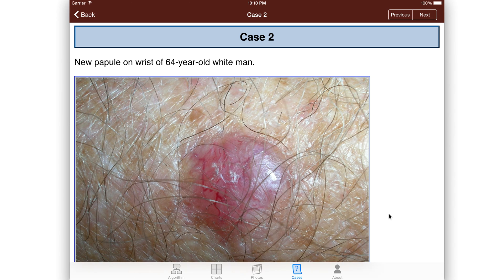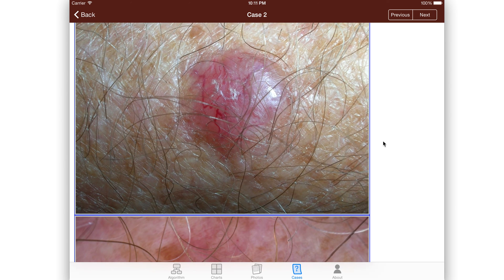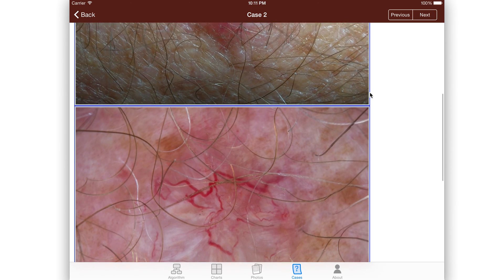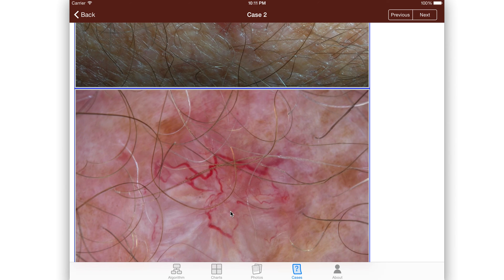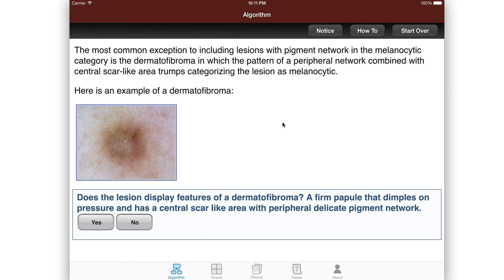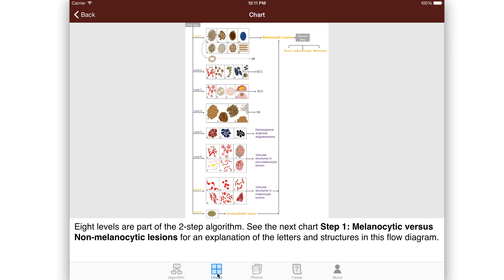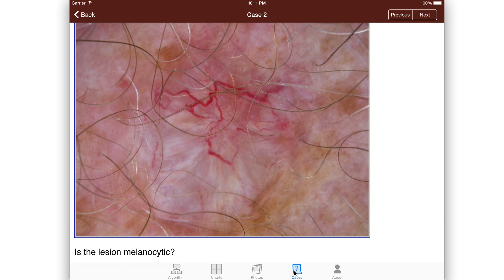There are 50 of these cases. This one will be a basal cell carcinoma, and it'll have the patterns typical of a basal cell carcinoma. So you've got your algorithm, and we can start over here at the beginning. You've got your charts, your photos, your cases.